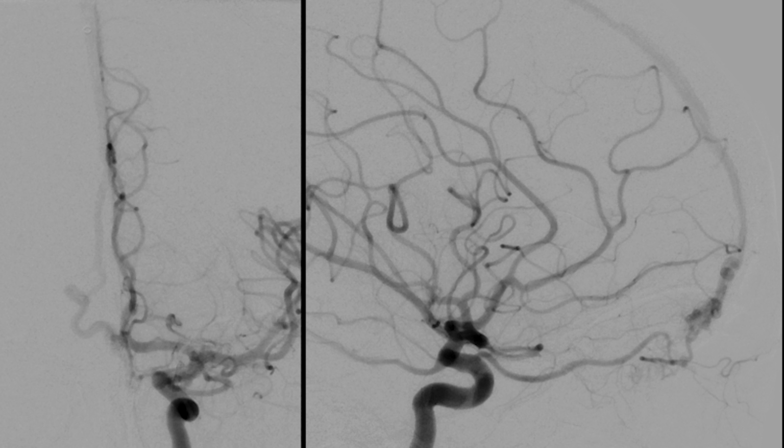Then with a 5 French distal access catheter, which in this case was a Catalyst 5, we were able to reach the rostral side of the superior sagittal sinus, and then we used a double lumen balloon catheter, which in this case was a Scepter, to go all the way towards the draining vein and then retrogradely inject our embolic agent towards the fistula.